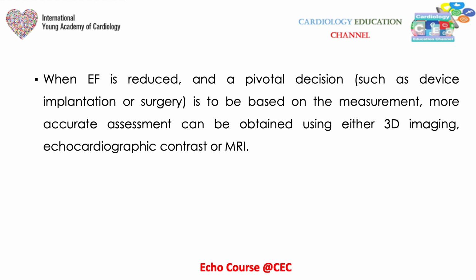When ejection fraction is reduced and a pivotal decision such as device implantation or surgery, as in valvular heart disease, is to be based on the measurement, more accurate measurements can be obtained using either 3D echocardiography, contrast, or magnetic resonance imaging.